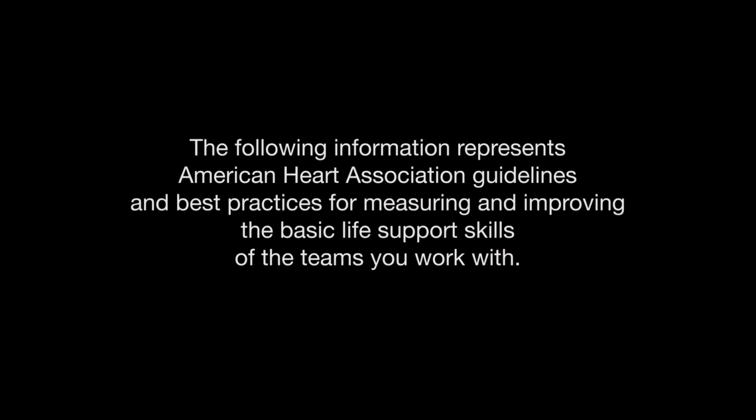as gloves. The following information represents American Heart Association guidelines and best practices for measuring and improving the basic life support skills of the teams you work with.